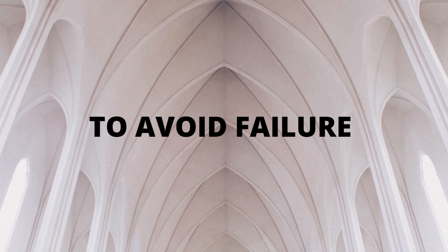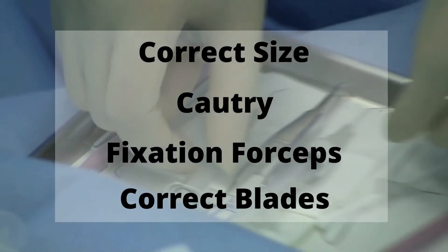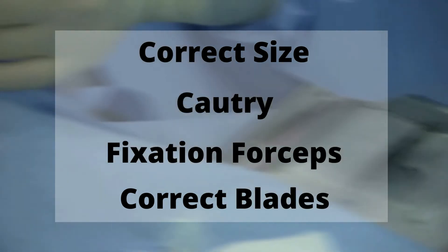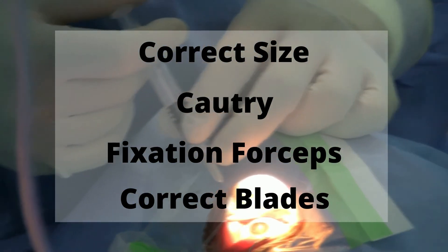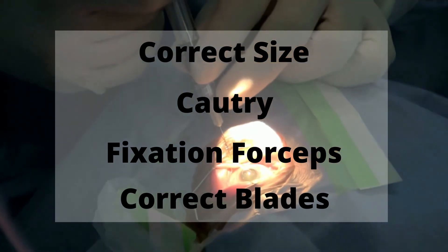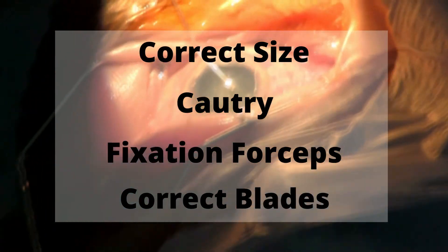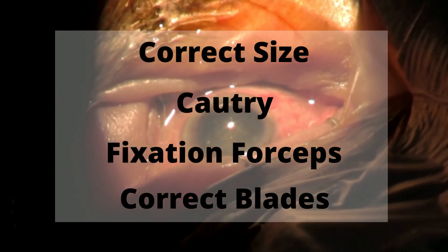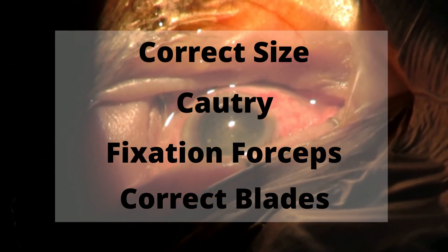To sum up, complications during tunnel construction can be avoided by: accurate assessment of tunnel size, scleral cauterization to reduce bleeding, globe fixation using fixation forceps, and use of a sharp crescent knife and keratome with the correct bevel and size.